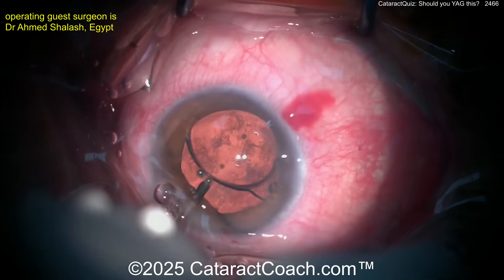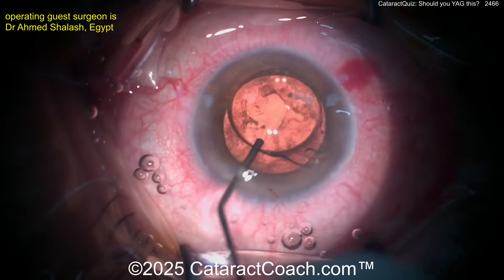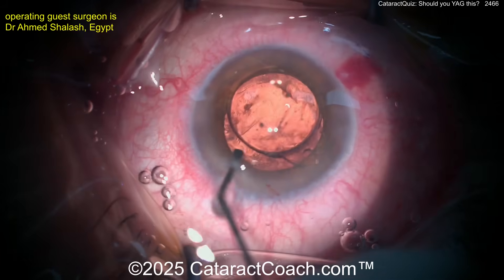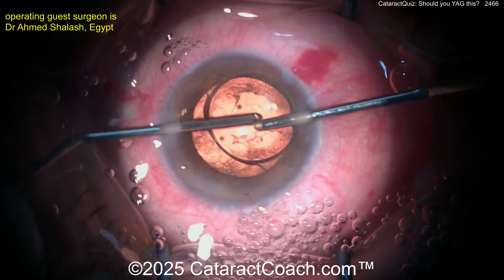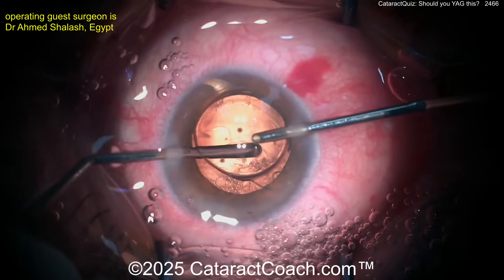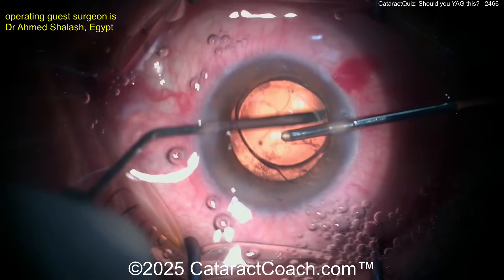What about another technique? How about a power wash — injecting BSS and power washing the capsule? Look at this: you can get almost all of this lens material, these lens epithelial cells, aspirated and loosened up pretty easily. Now go behind there with the IA probe set up, and aspirate, aspirate, aspirate — you can really clean up that capsular bag. Very interesting approach here.